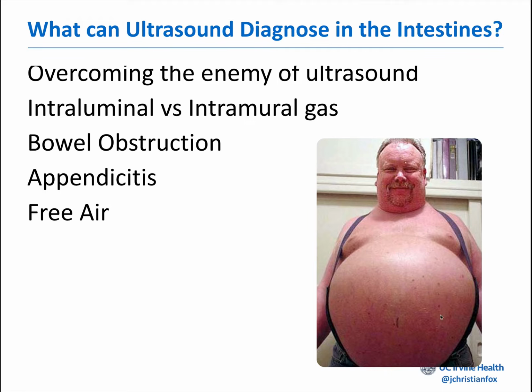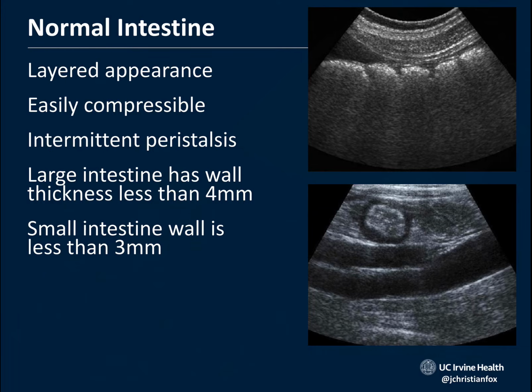Should this really be a small bowel obstruction, then ultrasound will fare quite well. Ultrasound for small bowel obstruction, no matter how distended or large a patient seems, does quite well. Appendicitis on this guy, another story. It would be nearly impossible to find his appendix because he's such a large individual.